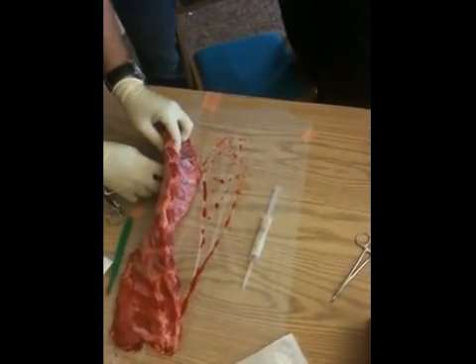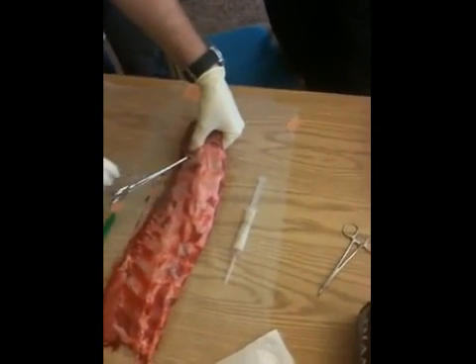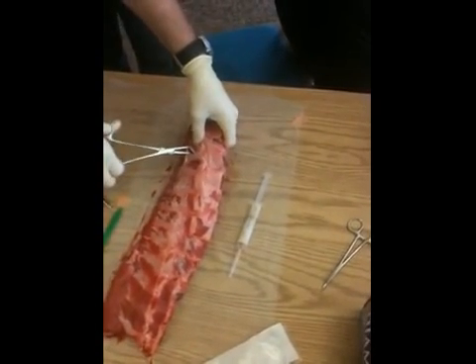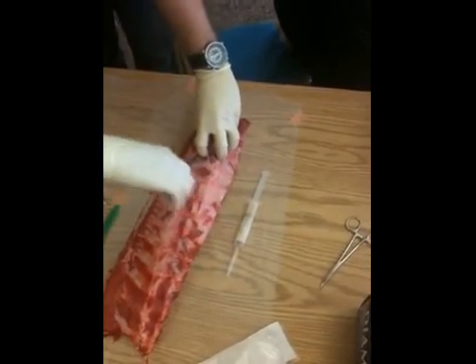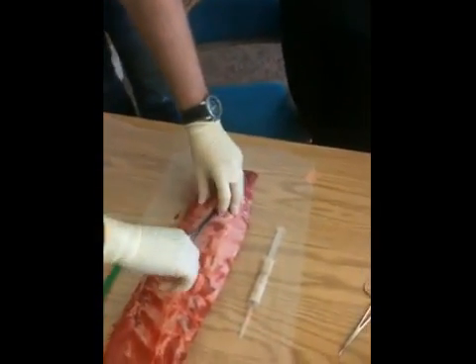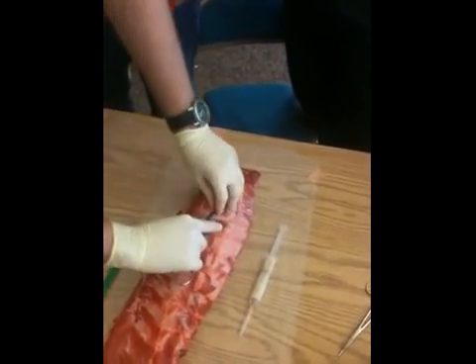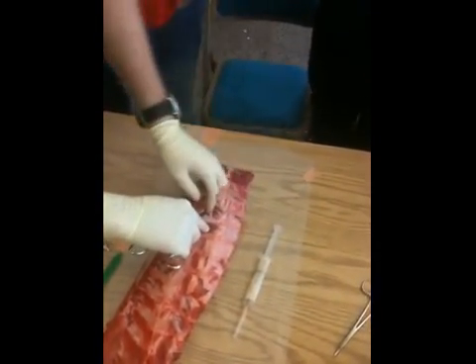That's the pop you heard a little bit — about five to ten seconds ago. You'll feel a big pop there. Then I'm going to go ahead and bluntly dissect that open, making myself a good hole to work with. Your patient's going to be very uncomfortable during all of this. Once you put something in there, it's just like a crike — you never take it out because that thing can seal back up and you'll never find it. So always keep something in there.